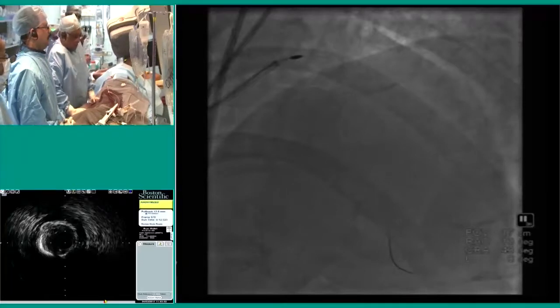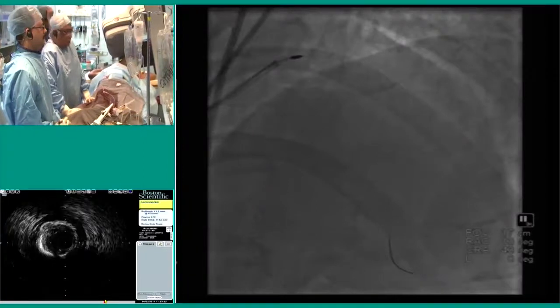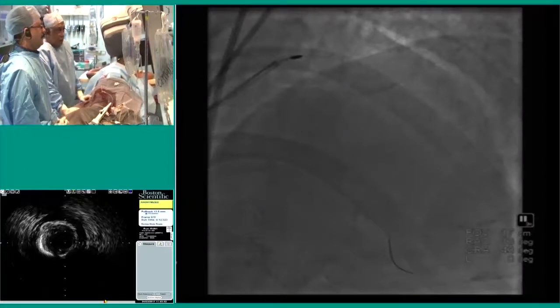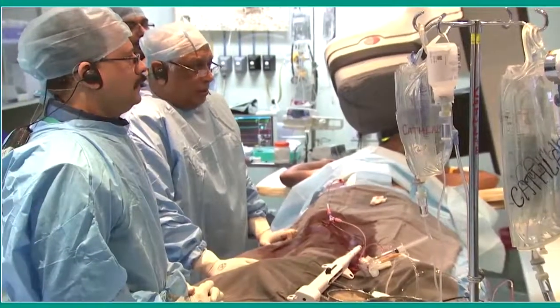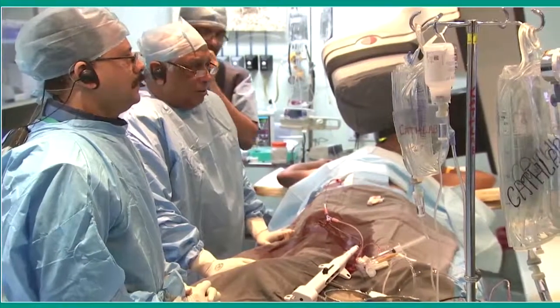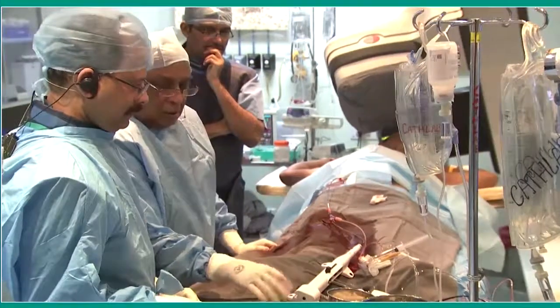So, that'd be good. And Mathew, do record your breaking that lesion on a cine so that we can see what sort of pressures it took for the lesion to give way. You know, that calcified area. We'll do that. Okay.